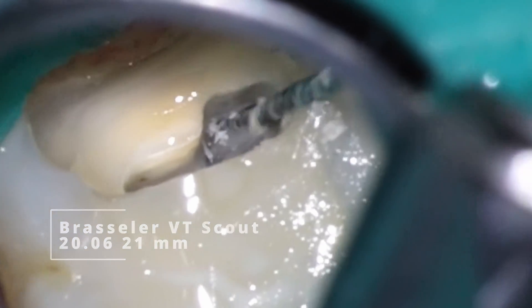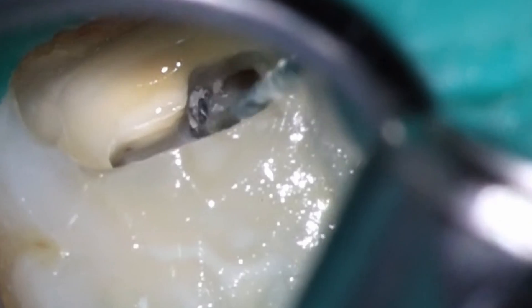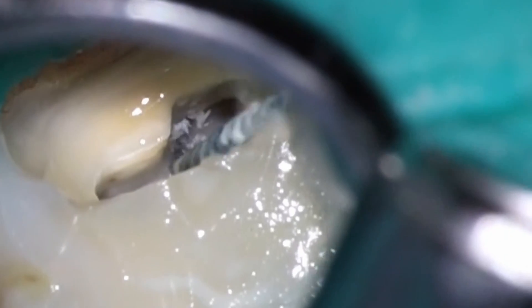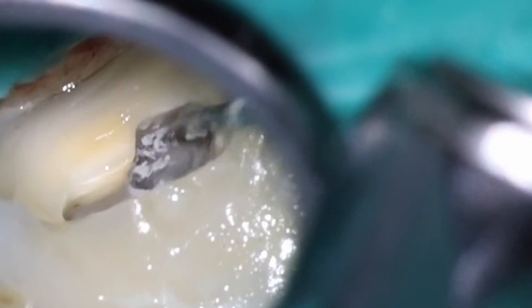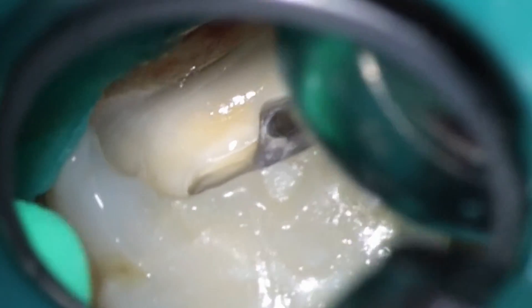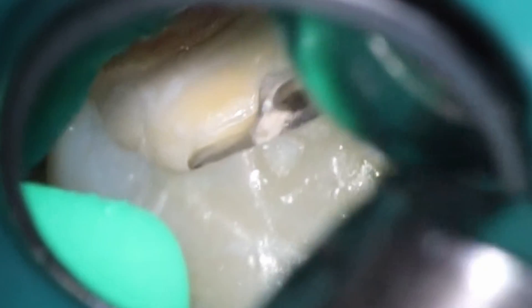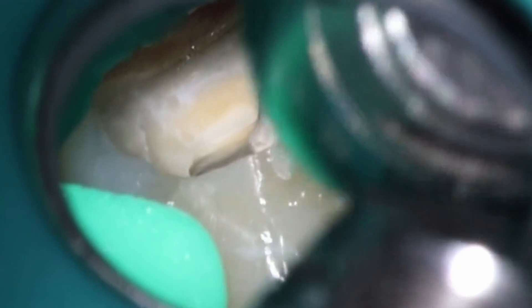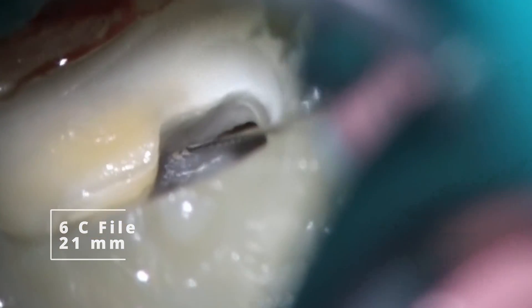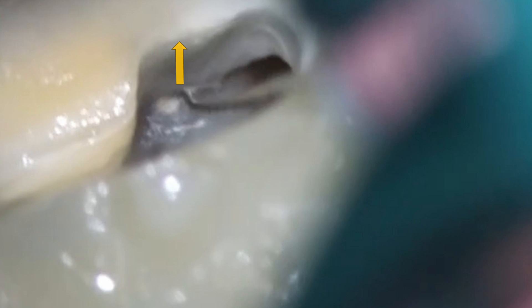I'm going to try the 2006 here to see if we can get anything in there. I'm not really concerned about debris on the file since we're only going in about a millimeter or so. Not really getting too much with the rotary files — maybe a little stick here or there — and that's what I'm feeling for as well. At this point I've switched to the EG3, which is my sharp, almost arrowhead-shaped bur. The thing to remember is it cuts most effectively laterally, so you'll see me almost brushing with it rather than going too far apically — I'm trying to unearth any calcifications on top.